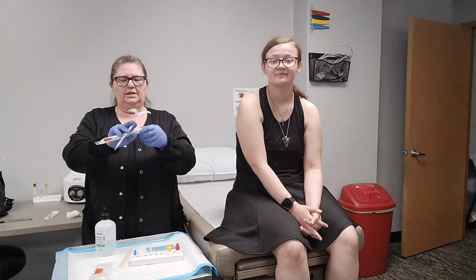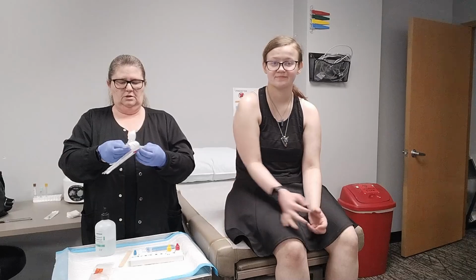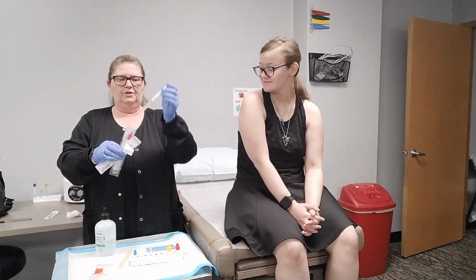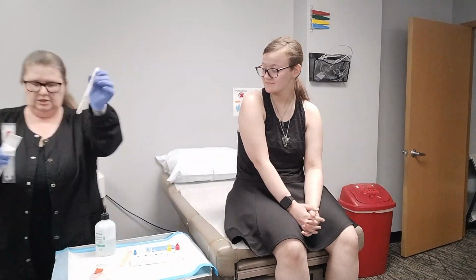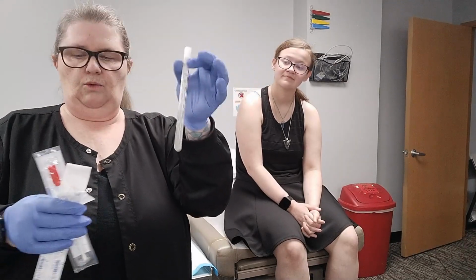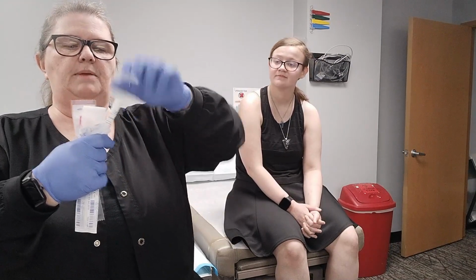I just open the end first so that I don't have to have my swab be out. Now, the transport medium here in the tube, I will go ahead and take fully out, and I'm just going to twist the top. I'm not going to take it off.